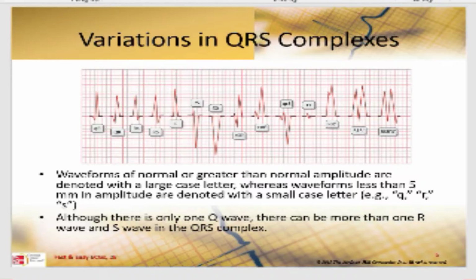If you have a higher than normal amplitude, that means that it's found in the precordial leads. So if you're using the precordial leads, it's going to look very tall. It also, if it's very tall, means that there is ventricular hypertrophy. And if you remember from medical terminology, hyper means more than normal, trophy is development. So that muscle will look big, but it's not usually toned. It's kind of flabby looking, so it won't work effectively. So you would think more heart muscle would be a good thing, but if it's hypertrophy, it's not very refined, effective muscle.